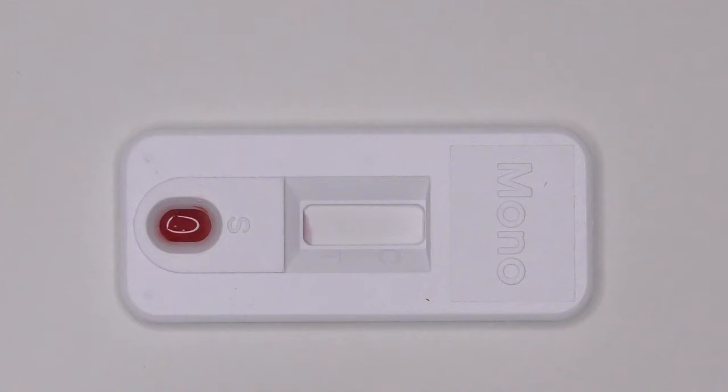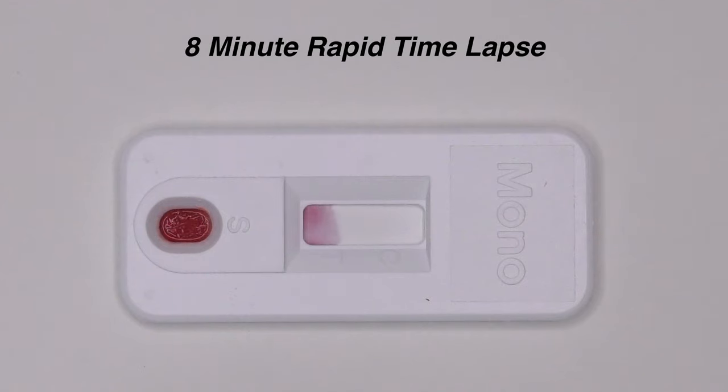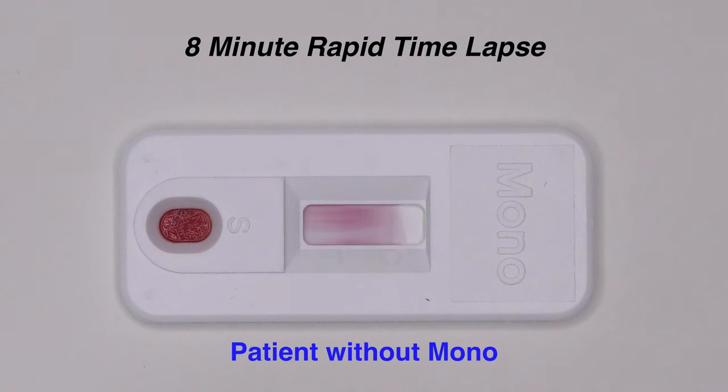The results are read after 8 minutes. Here is an 8-minute rapid time lapse showing a negative mono test result. Note that the red arrow points to the presence of a single red control band indicating a valid test. Given the absence of a second band, this test would be considered negative and the patient would not be considered to have mono.